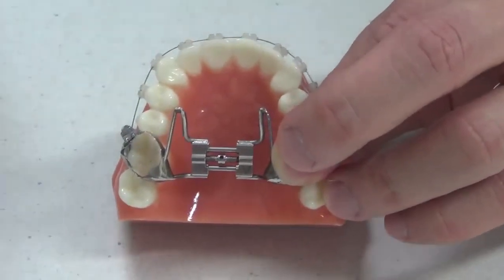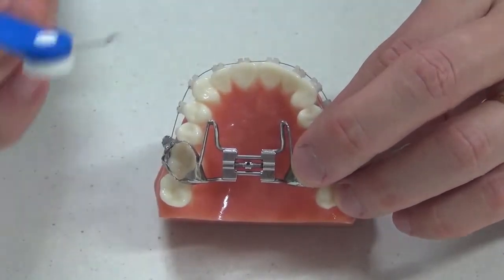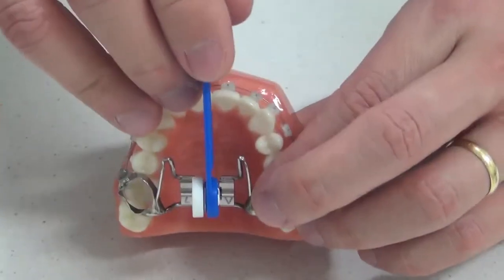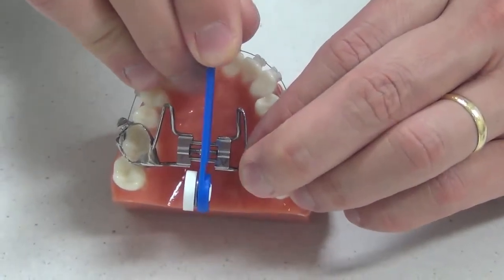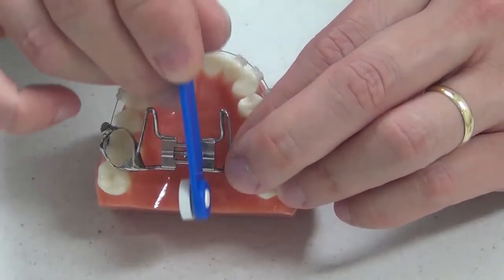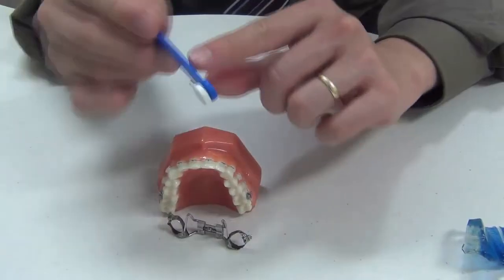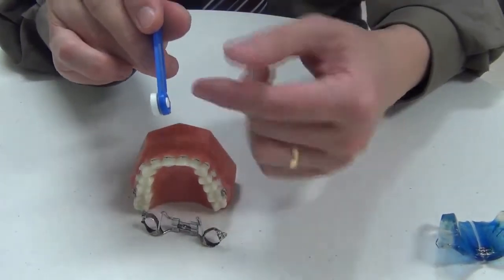There's an easy way to work around this. The first thing is bending the key so it's at about a 90-degree angle. Find the middle of the hole and line up the handle so it's centred between the two front teeth, then turn it until you see the next hole. As you turn, keep inward pressure and turn towards the back of the mouth. Expect the handle and wire key to bend as you turn — it starts straight, then bends as it moves the wheel and turns the expander.